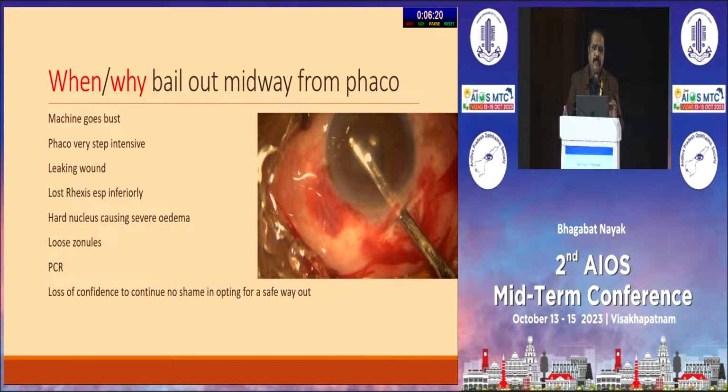And the last thing is the most important thing. When you have lost confidence in continuing phaco, there is no shame in converting. Please understand that. Rather you convert than have a drop nucleus.